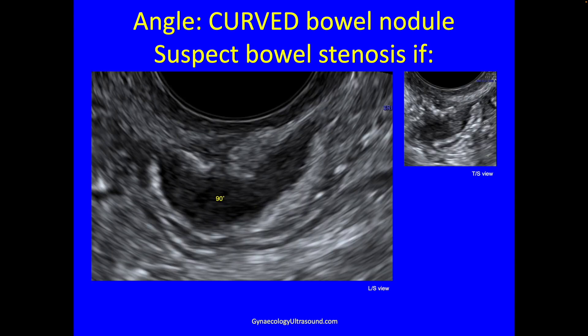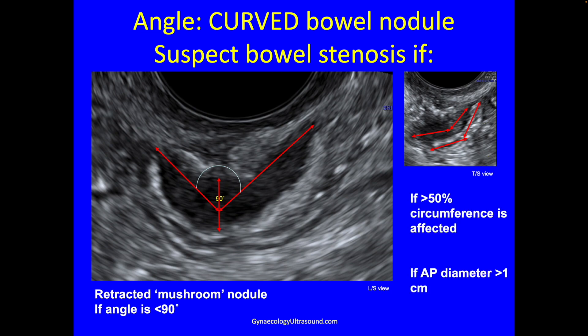When you have a curved bowel nodule you also think about stenosis. This is how you measure the bowel nodule: this is the angle between them, that's the depth, and that's the width. A retracted mushroom nodule — if the angle is less than 90 degrees we're going to think of bowel stenosis, if more than half the bowel circumference is affected, and if the AP diameter is more than one centimetre.